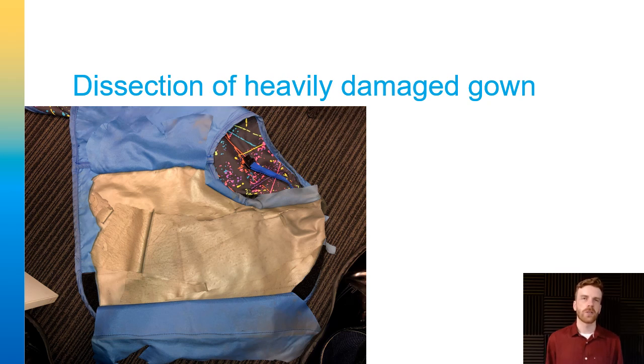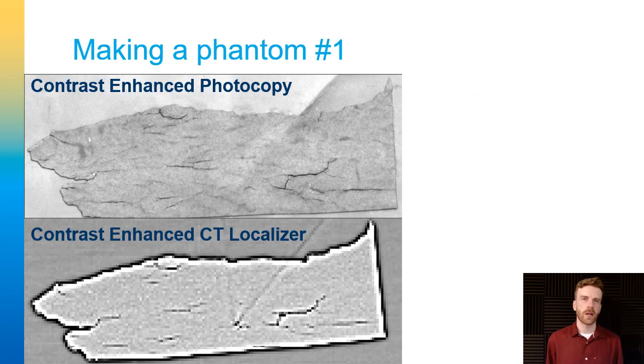I also noticed that there's some sort of plastic deformation going on, like stretch marks or something, and I suspect these marks eventually fatigued into the cracks and tears that caused it to fall down. So I cut out a piece that had both cracks and deformation marks and glued it to an undamaged piece.